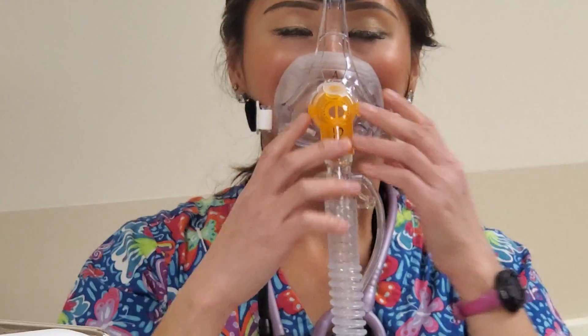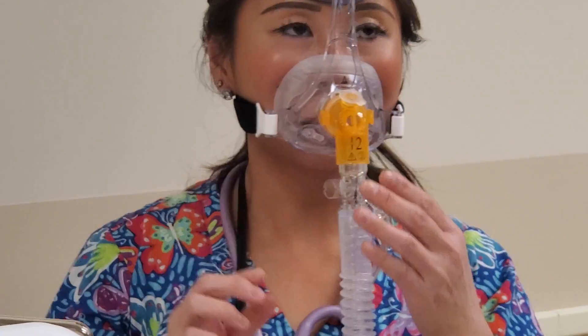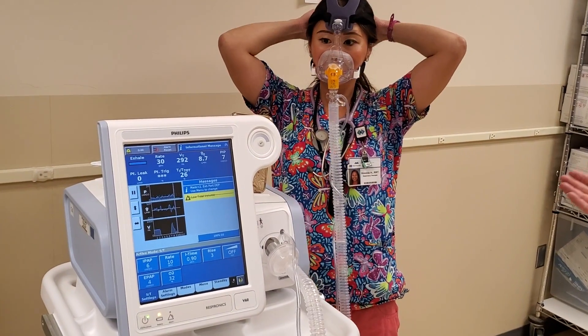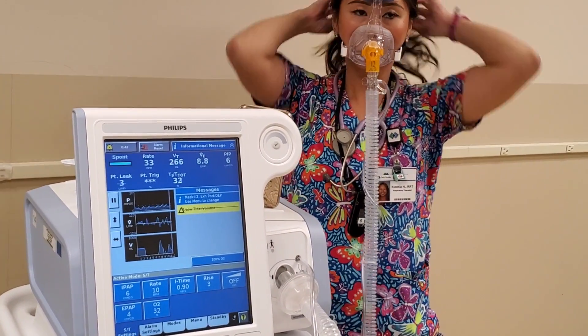Does that feel under your nose? Yeah. Okay, and so that's the under-nose mask. You'll see that on the floors, just to be aware of it and how it works.